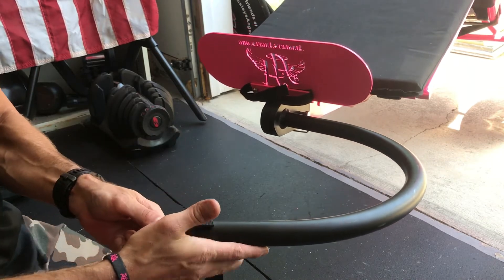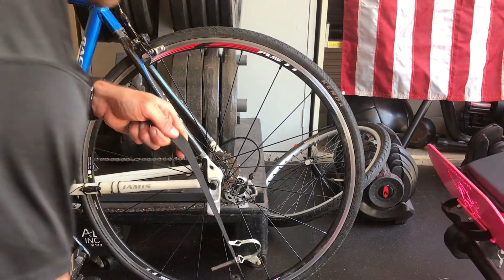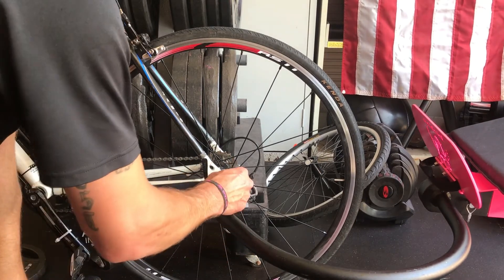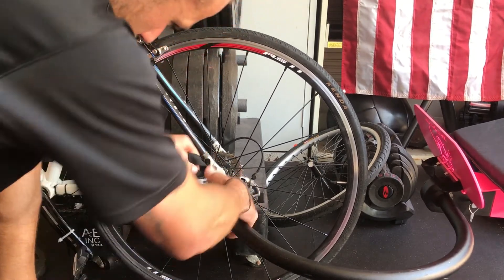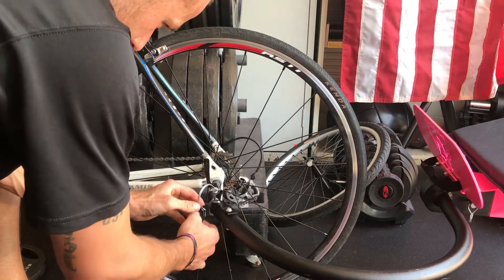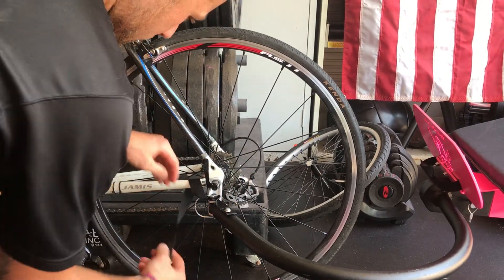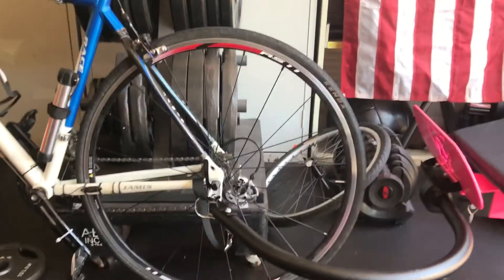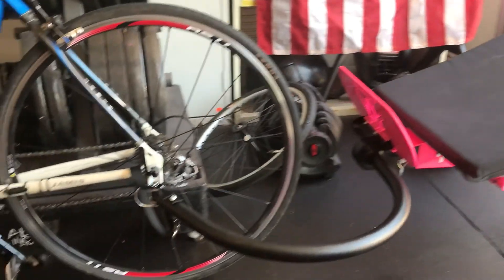Now that the boom is attached to your Hoyt Blade, the next step is attaching it to the bike. It will slide into the piece we put on earlier. You have your first safety mechanism — a pin which goes from the top down to the bottom once it's all lined up — and that clips in at the bottom. Then just like before, the secondary strap goes around your bike and clips in at the bottom. Now you're all set — your Hoyt running chair Blade is hooked up to a bike and you're ready to roll. Have fun!